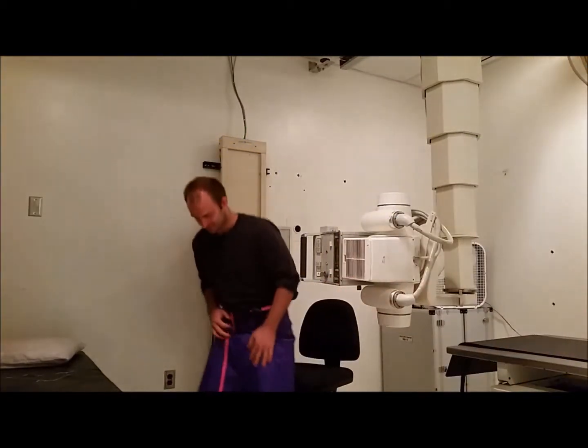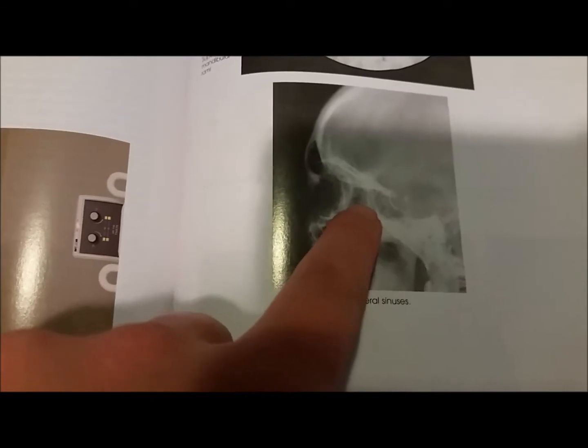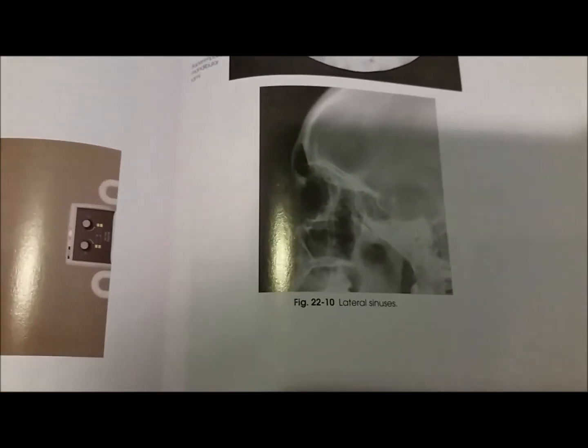You too. All right, we'll go over the images that we would have taken for our sinus series right here. First would be the lateral sinuses, which allows you to see all four in profile there, beginning with the frontal, ethmoid, sphenoid behind it there, and the maxillary. In the true lateral, you should be able to see the sella turcica as well right there, and the orbital roofs should be superimposed.